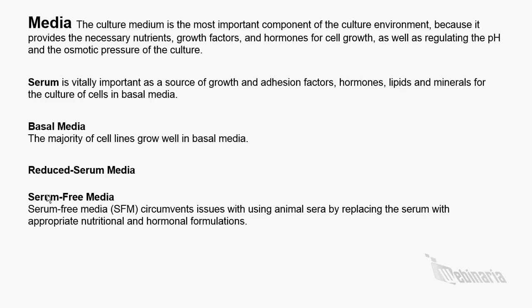Serum-free media. Their formulations exist for many primary cultures and cell lines, including recombinant protein producing cell lines. One of the very famous is Chinese hamster ovary, various hybridoma cell lines, the insect cell lines SF9 and SF21 from Lepidoptera, and cell lines that act as hosts for viral production, like Vero, 293, MDBK, and MDCK. These are the mammalian cell lines. One of the major advantages of using serum-free media is the ability to make the media selective for a specific cell type.